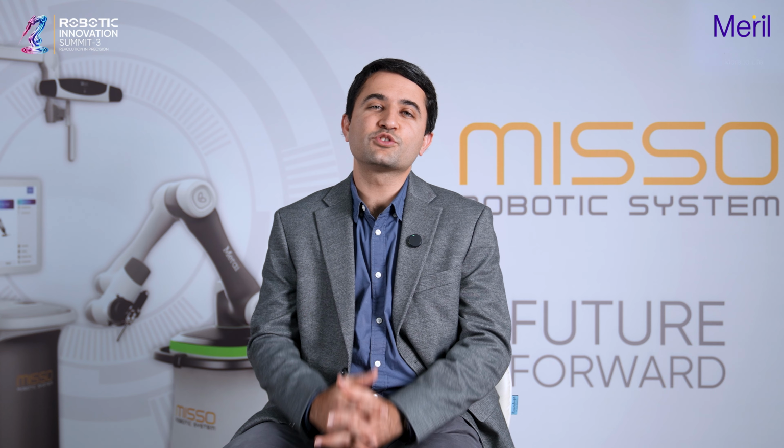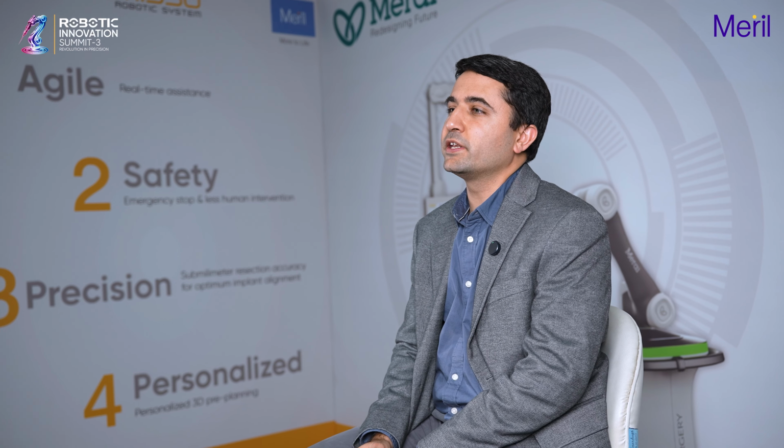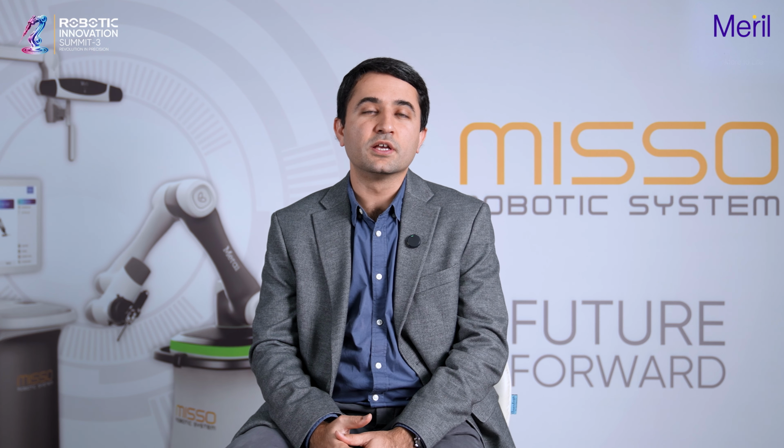I think one of the highlights of robotics, the most powerful advantage of robotics, is its ability to assess the soft tissues. That means the laxity patterns, the tightness patterns, whether it's the medial side, lateral side, in extension or flexion. That assessment which we earlier didn't have with conventional. Robotics has come in and allowed us to assess those.